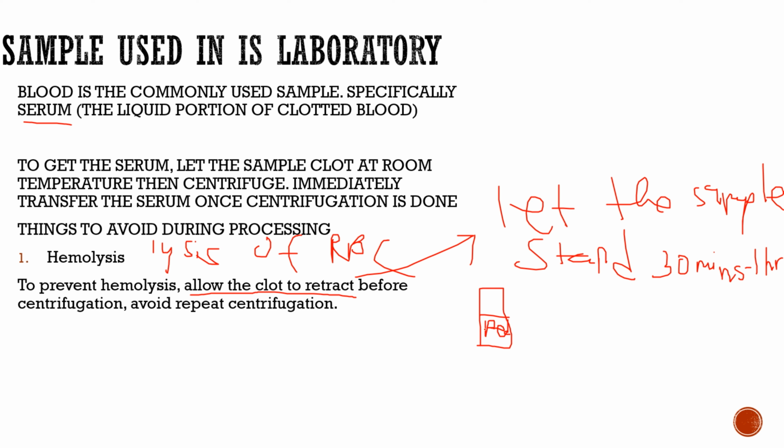Pag nakita mo nang in-stand mo siya ng 30 minutes to 1 hour, makikita mo na magdi-decrease yung clot dito, bababa. Makakakita ka na dito ng serum. And to fully separate that, kailangan nyo siyang i-centrifuge.